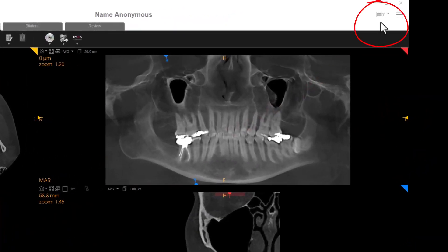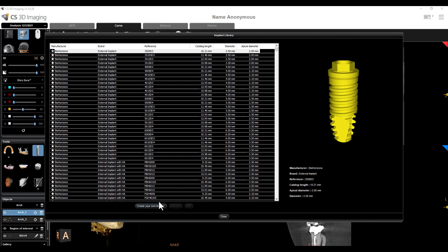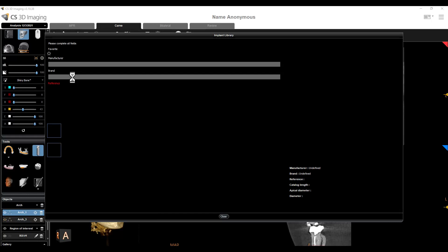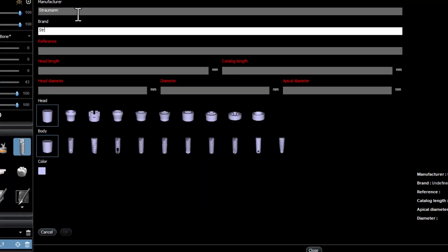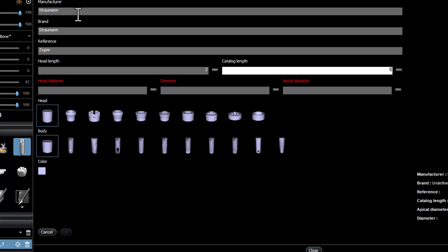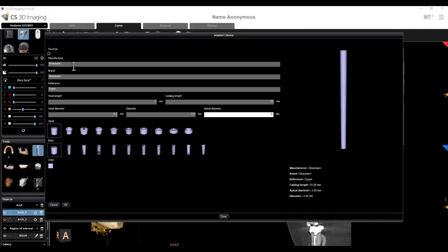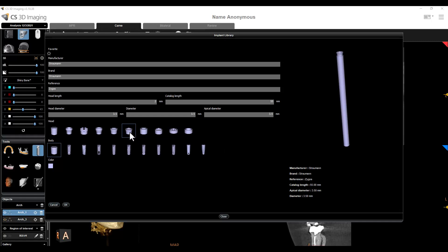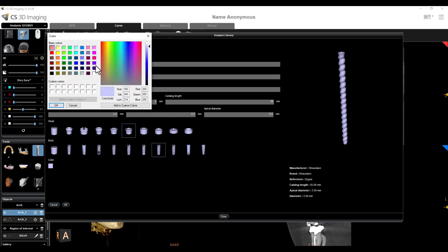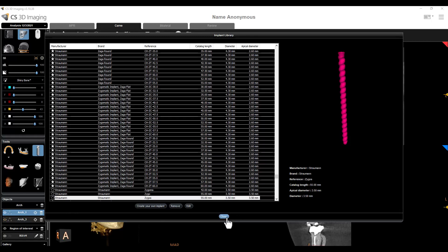So first you'll select the icon in the top right — it says custom implant management, it's that middle icon — and then you'll select create your own implant. You can begin building the implant: put whatever manufacturer brand and reference you want. The head length is really up to you. Catalog length is going to be how long you want your implant. Head diameter should likely be the same diameter as the actual implant. You can also set a different apical diameter, and you can see as you make those selections you begin to build your implant. Then you can select which head you want and the threads, and you can see it building as you go. I like to choose a different color because it stands out a little bit better than that little purple. Then when you're done, select OK, then select close and you're ready to plan your implant.